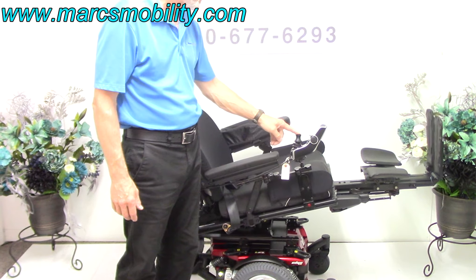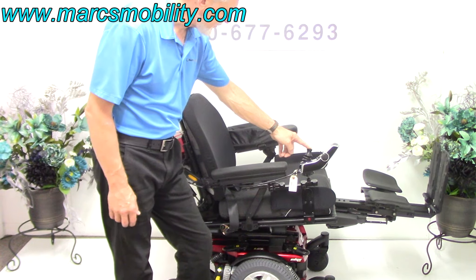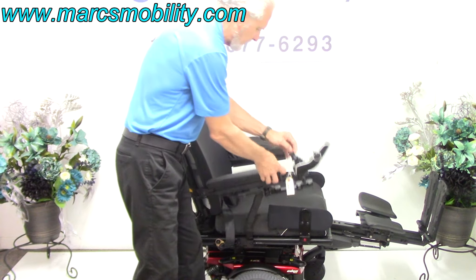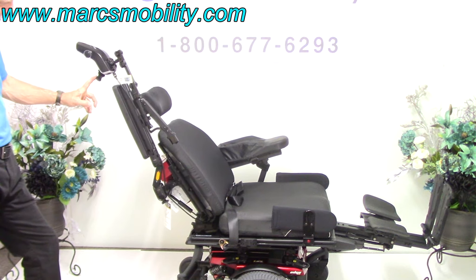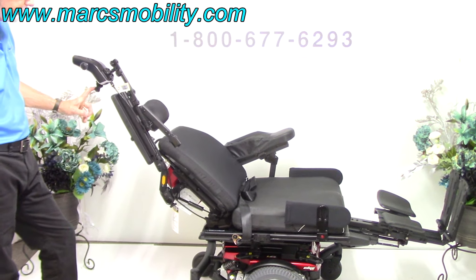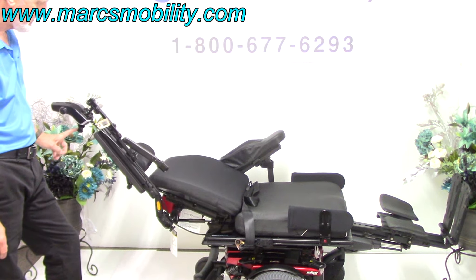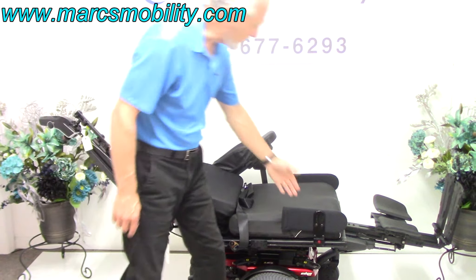Let me bring everything all the way down. The last function to demonstrate is the electric recline — that's just the back going back by itself. This is the electric recline right here, with the back moving independently from the seat.